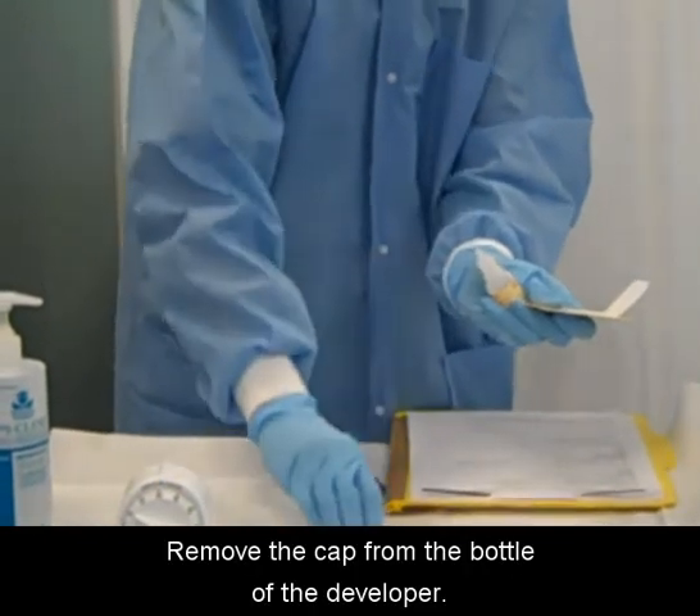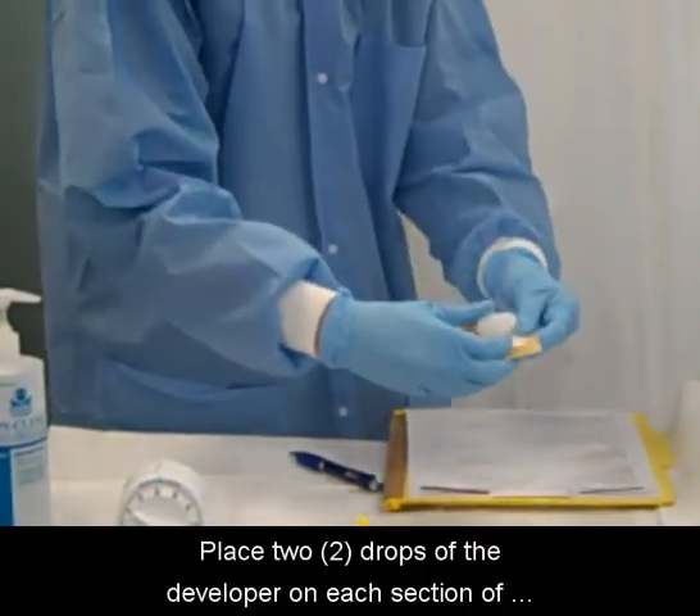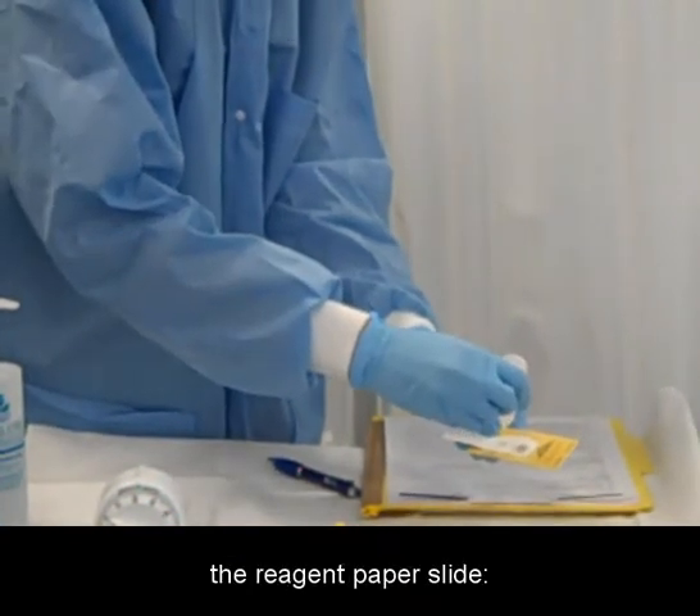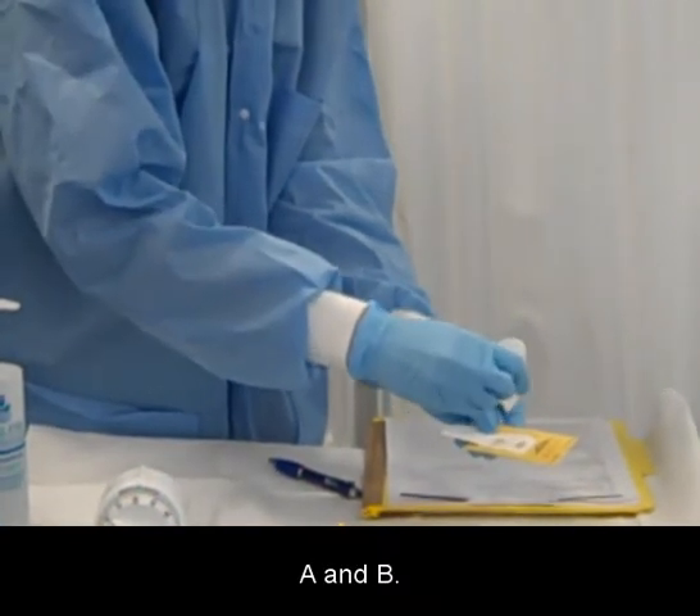Remove the cap from the bottle of the developer. Place two drops of the developer on each section of the reagent paper slide, A and B.